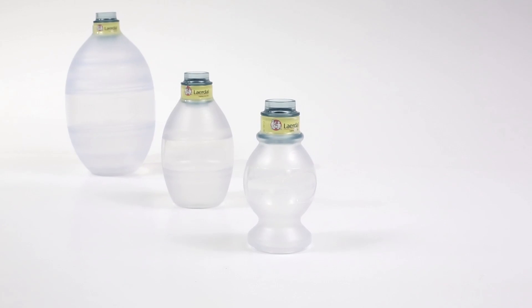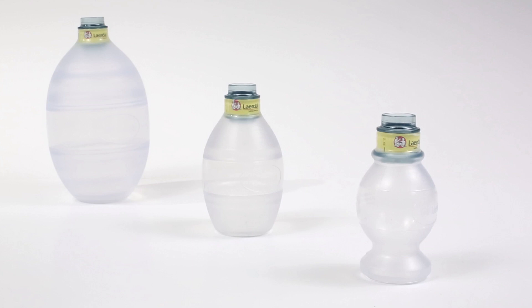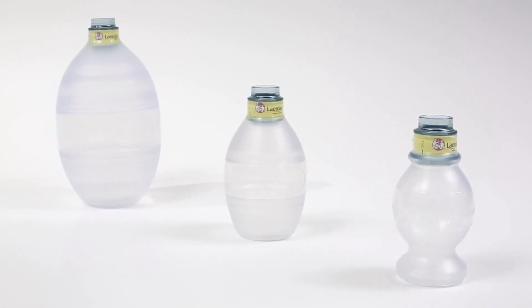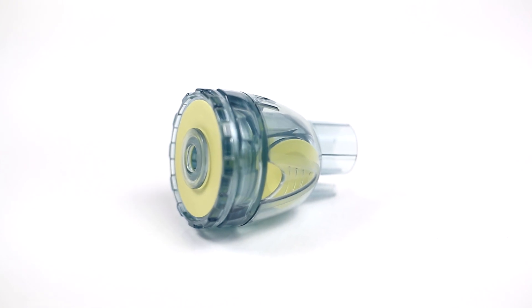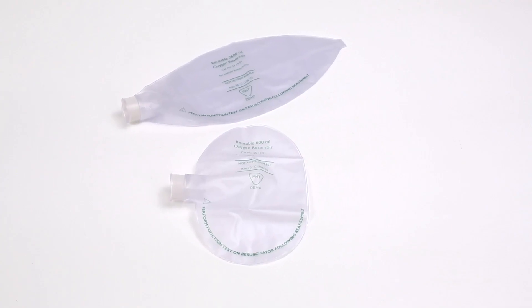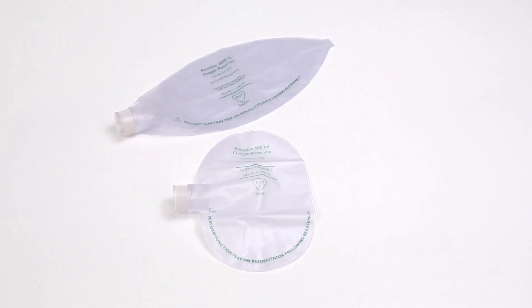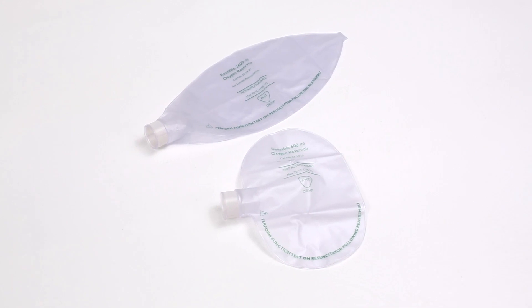The transparent silicon ventilation bag provides excellent re-expansion and is resistant to extreme temperatures. The LSR has an integrated one-way intake and reservoir valve. An oxygen reservoir bag can be attached to the intake and reservoir valve to store oxygen when the LSR is connected to an oxygen source.